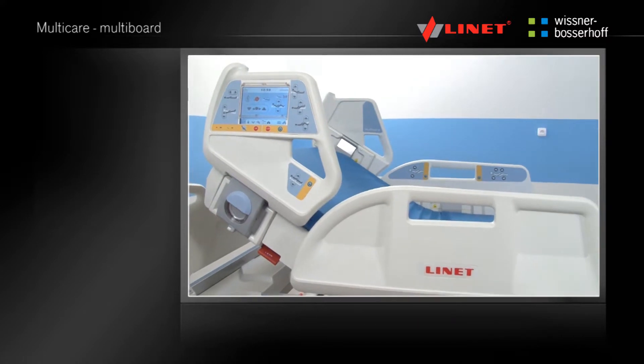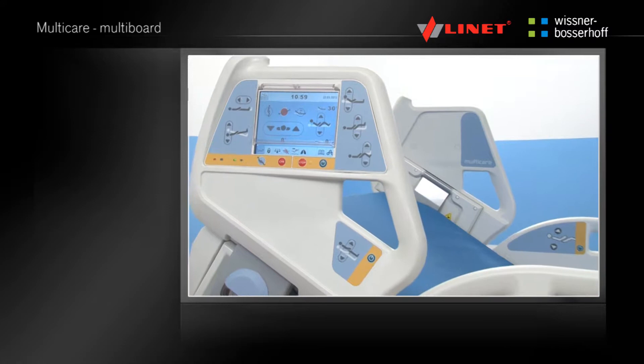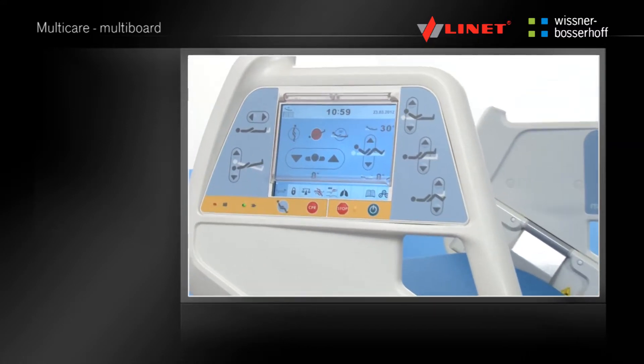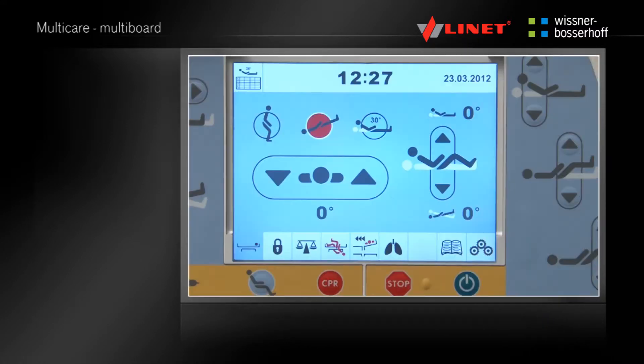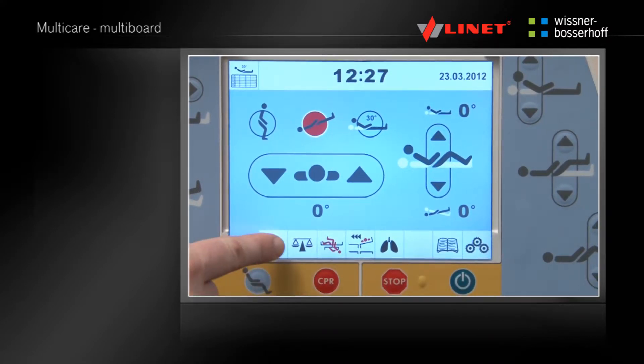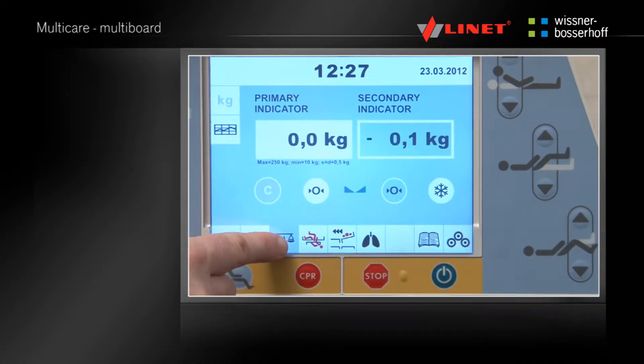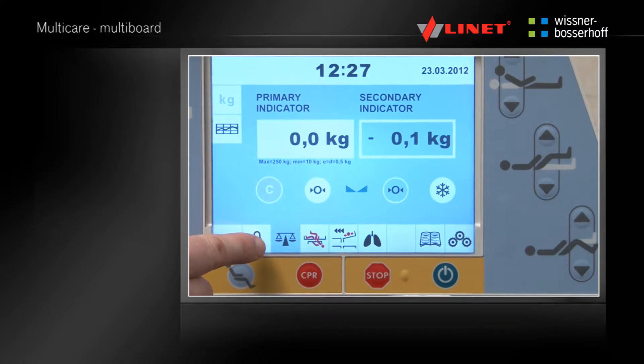The MultiBoard is an LCD touch screen located in both head side rails and is the main control element of the bed. After pressing the activation Go button, you can adjust the bed height, lock the bed functions, access the scales and use many other practical functions. You can find more in the chapter MultiBoard.